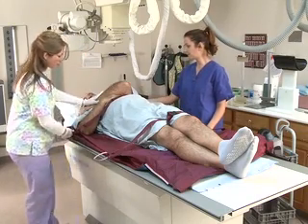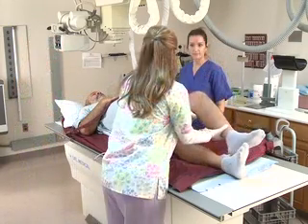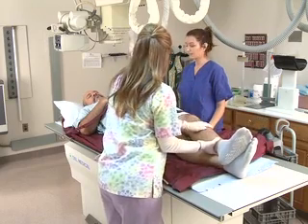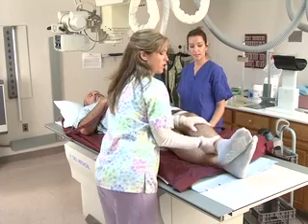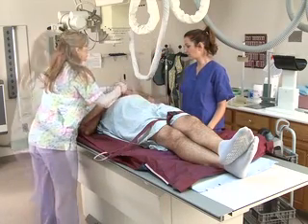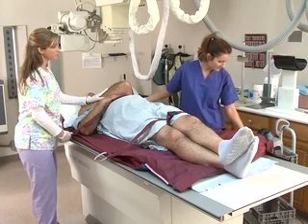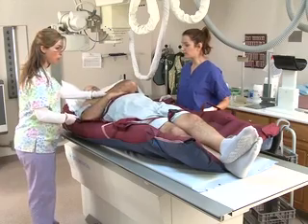The leg opposite the turn can be placed in one of three positions. It can be bent at the knee, or if no hip precautions exist, crossed over the other ankle. If neither position is comfortable, it can rest in a supine position beside the other leg. Once the patient has been positioned, assume the position of safety and have the other caregiver turn on the air supply to inflate the HoverMatt.